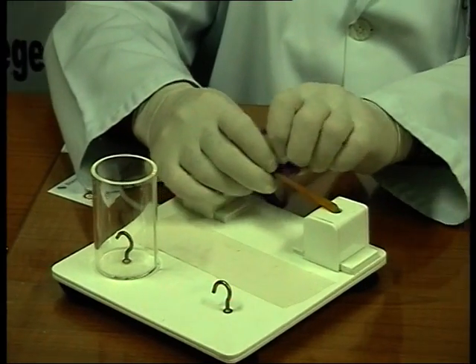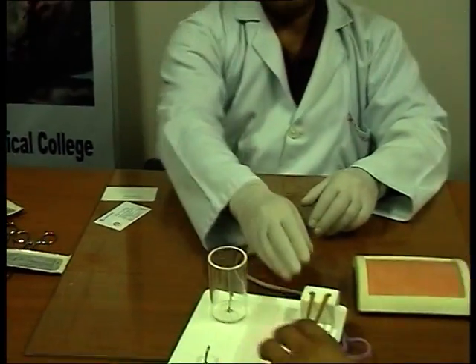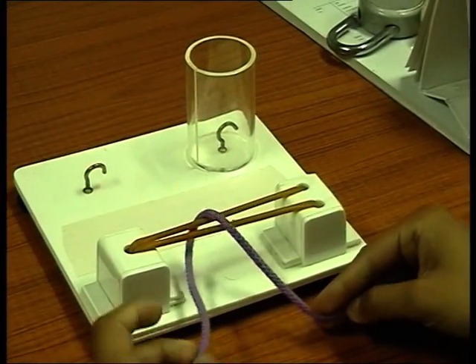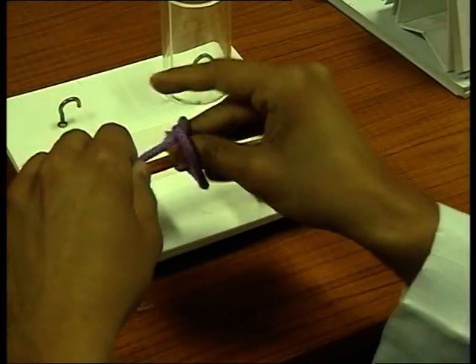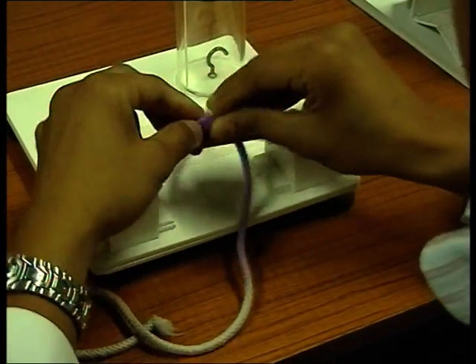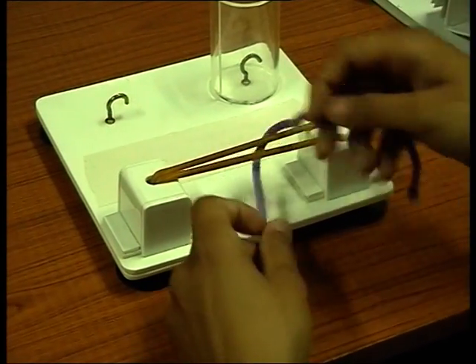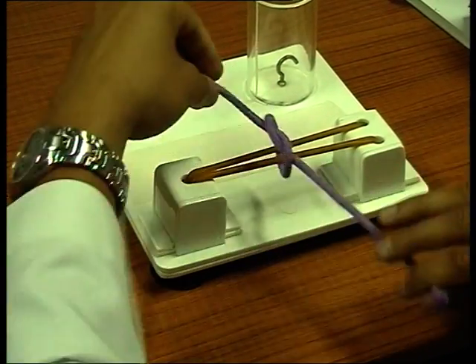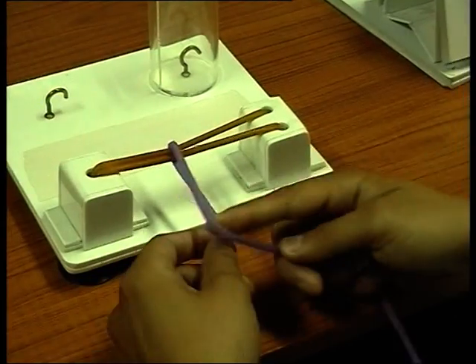So surgeon's knot is clear? Yes, sir. Put the surgeon's knot quickly. This is the reef. Yeah, cross, cross. Do it slowly. Open it again, do it again. Two throws to the same, do the left hand.